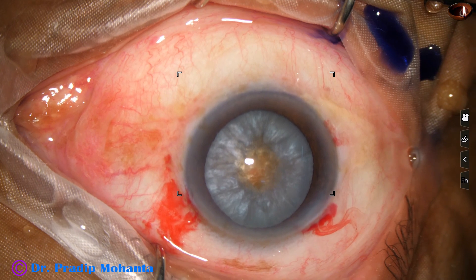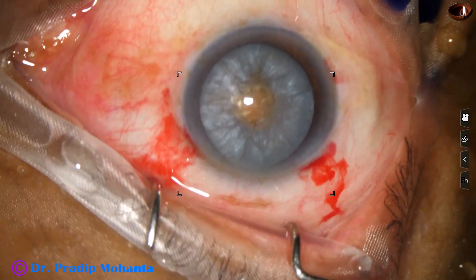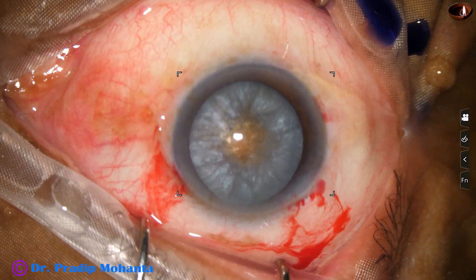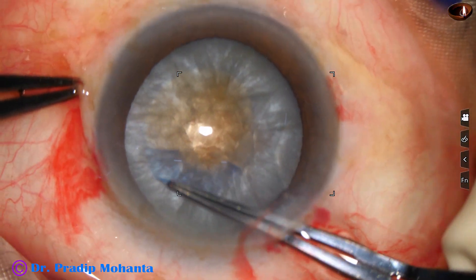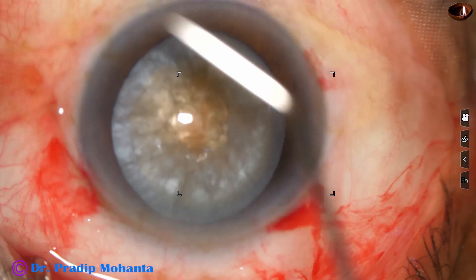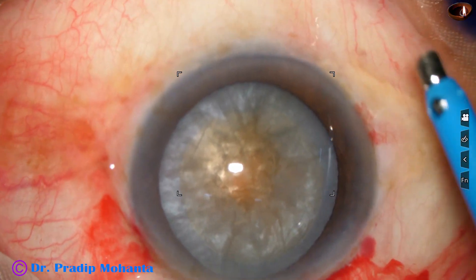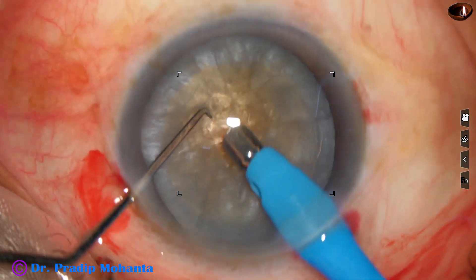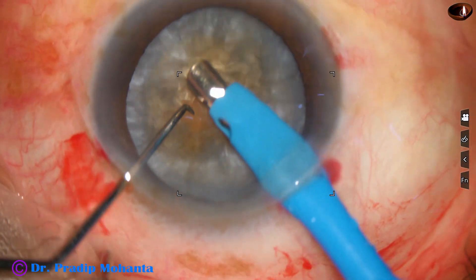This is an intumescent cataract and under the white cover there is a hard nucleus. We can see the brown tinge of the nucleus. After making a small rhexis and decompressing the nucleus — that is reducing the intralenticular pressure — we are enlarging the rhexis to an optimum size of about 5.5 millimeters. When the nucleus is brown and hard with nuclear sclerosis grade 4 or above, we should do a large rhexis; otherwise there will be zonular stress and nucleus management will be difficult.